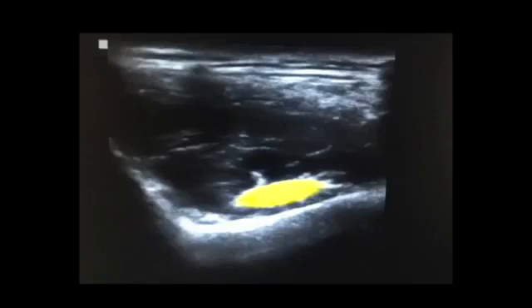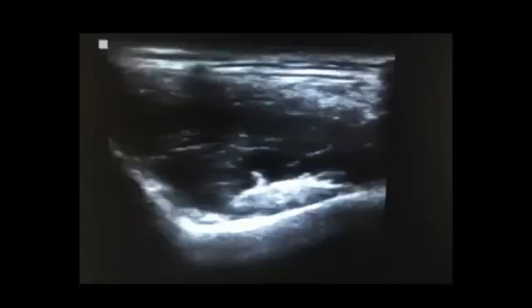This is the view you want to have prior to injecting. In order to perform the injection, insert the needle on the lateral side of the transducer in order to avoid any vessels. Have the needle travel all the way to the underside portion of the iliopsoas tendon so that it's in the bursa. Go ahead and perform the injection. And there you have a beautiful, simple iliopsoas bursa injection.